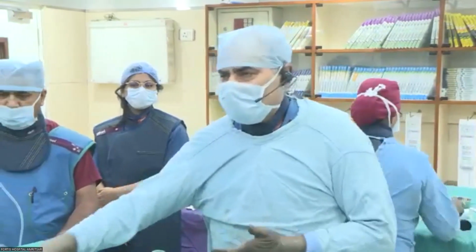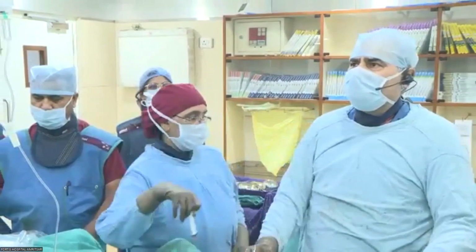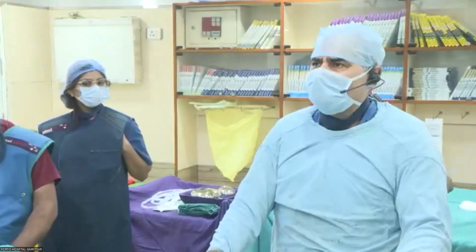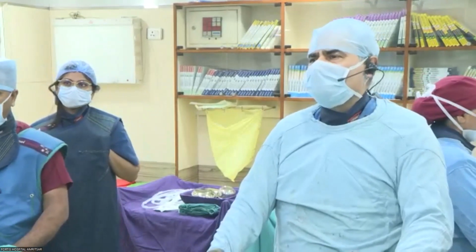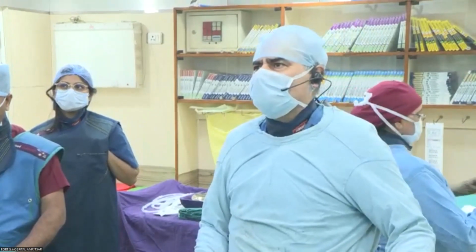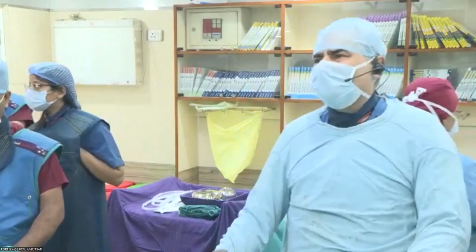But sometimes cutting balloon is hard to negotiate, especially with two wires there. There was a wire in the OM as well. So I thought I'll just create a small space there before going in. So one learning point is that cutting balloon, if it is the strategy, should be the first strategy and not a fallback strategy.